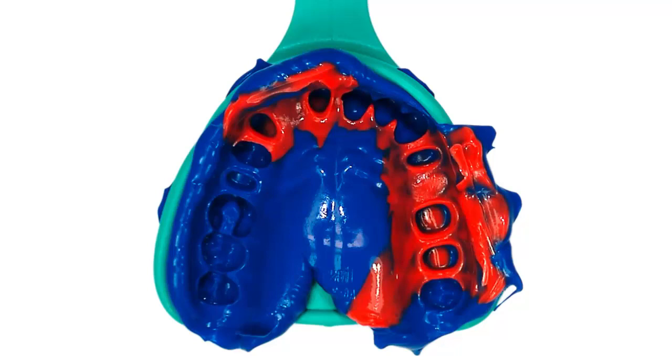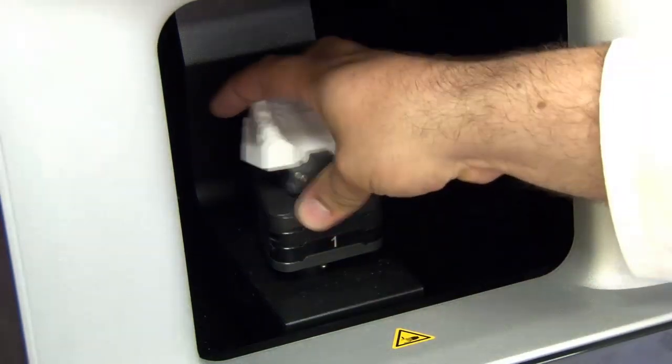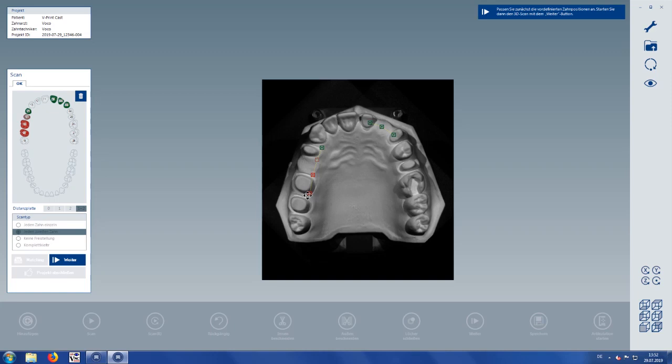Today we show the fabrication of cast restorations, starting with the impression of the prepared situation. In this case, the dentist took an impression and did not work with an intraoral scan. Both methods are basically possible. Our impression was filled with plaster to make a plaster model. This is transferred to the digital software in the laboratory using a scanner.